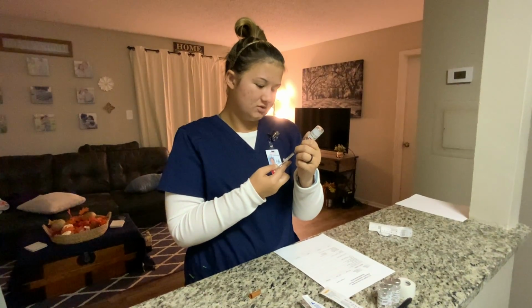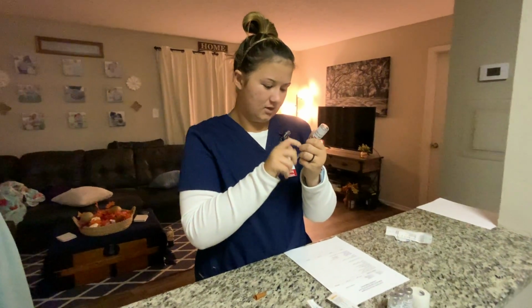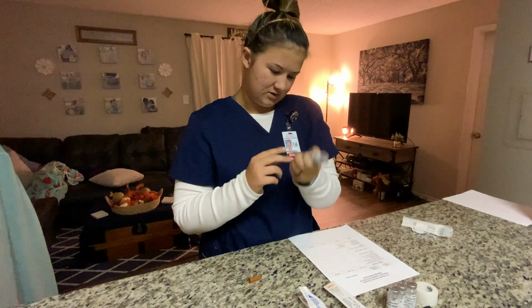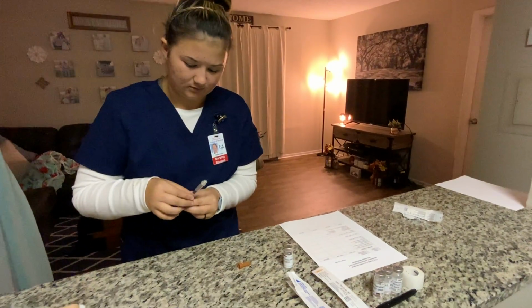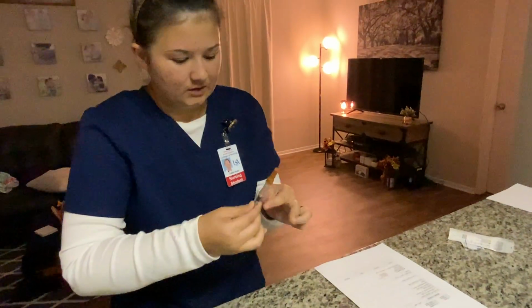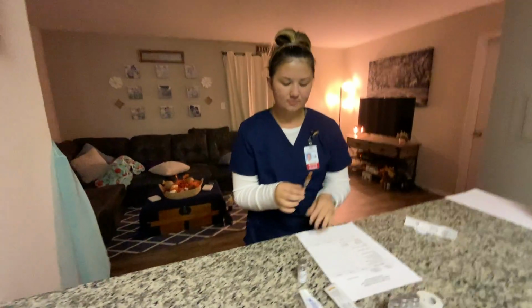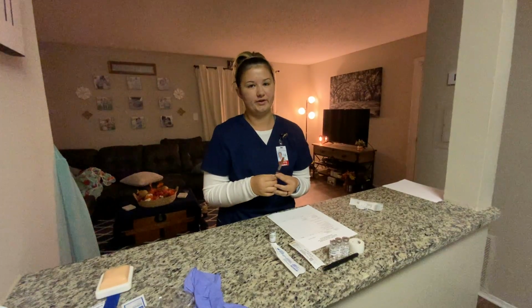I'm going to get a little bit more than 0.5 in case I have any bubbles, and I'm going to knock any bubbles out. And then once I know all my bubbles are out, I'm going to push it back up to 0.5. And then once I have 0.5, I'm going to take my needle out, and then I'm going to recap. And I have 0.5 milliliters. And once I draw out the medication, I'm going to get the nurse to double check me just to make sure I do have my 7 rights correctly done.